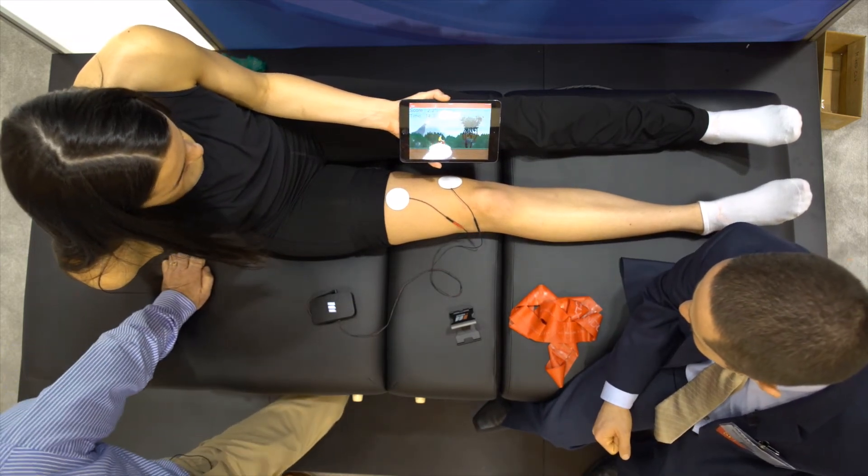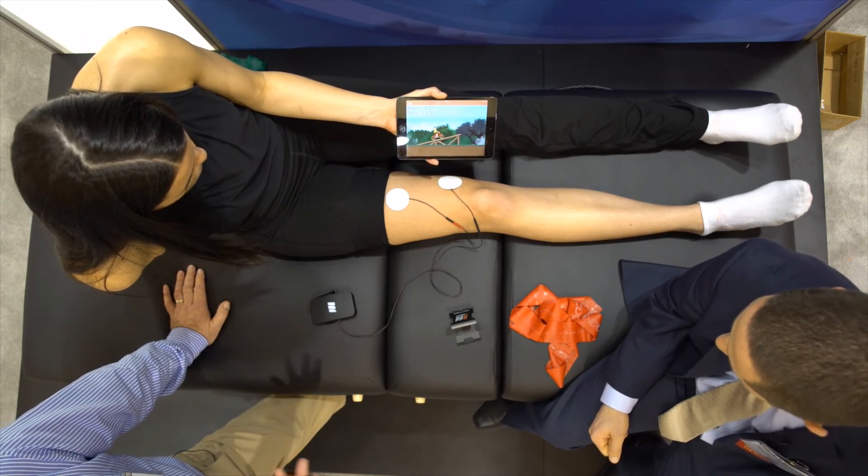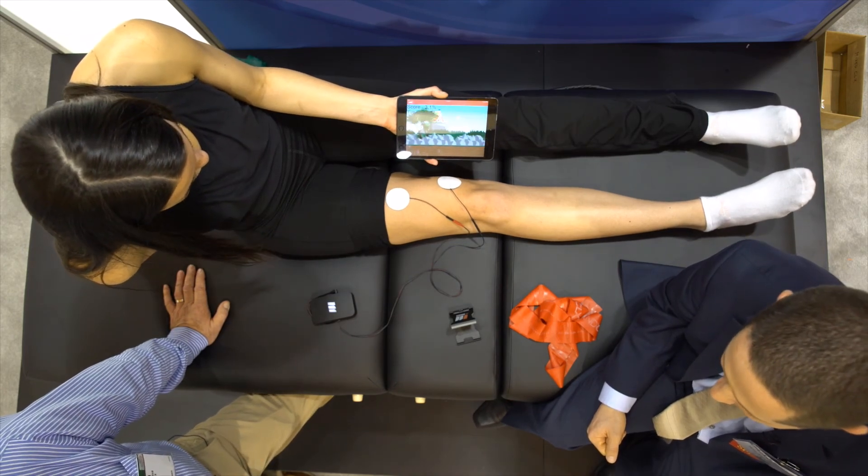Our patients love this — they're extremely compliant. It helps with muscle re-education, and not only for rehab. I've got some strength and conditioning people that are coming in who are really interested in this too.